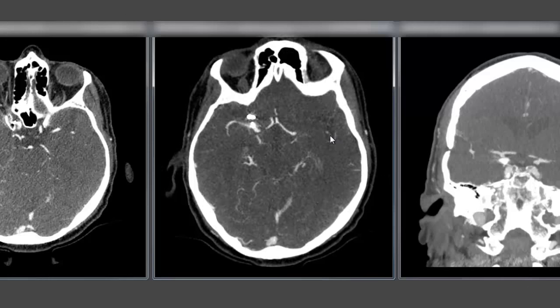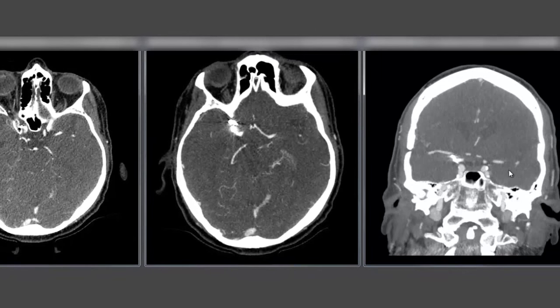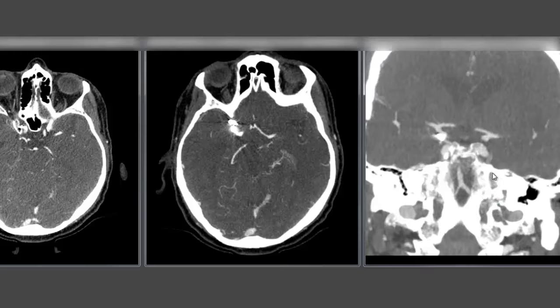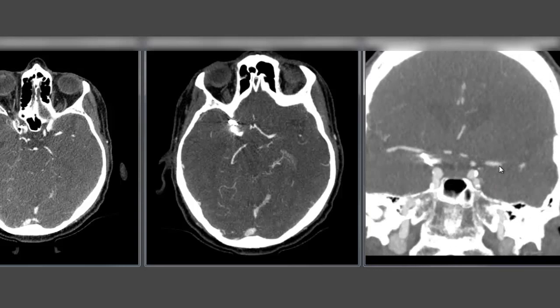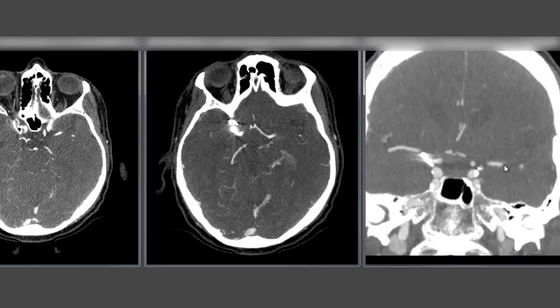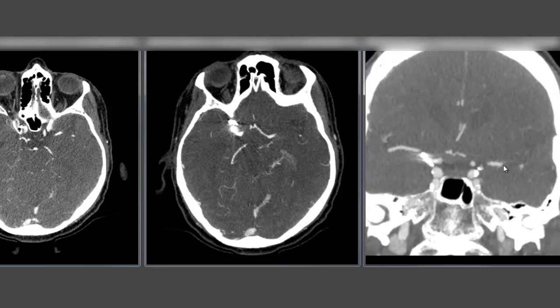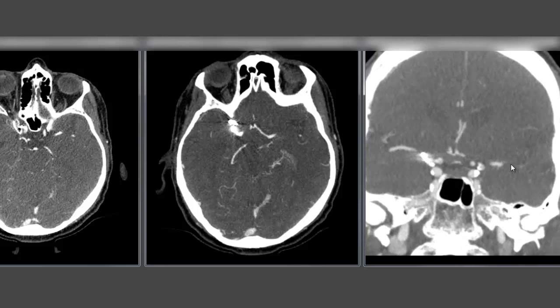Again we see some distal reconstitution in the sylvian fissure. And the same thing on the coronals — the carotid terminus, zooming in: A1, M1, and cutoff. Make sure to scroll fully through the stack to confirm there is no branch coming off at a sharp angle that you might miss. In fact there is none — it's just a hard cutoff from the clot causing this patient's stroke.